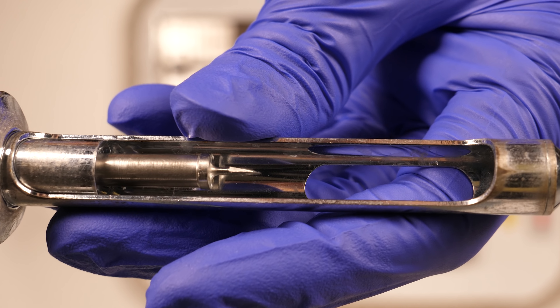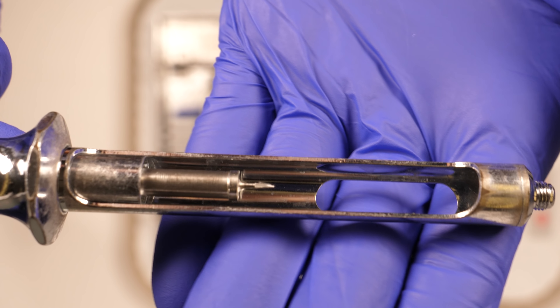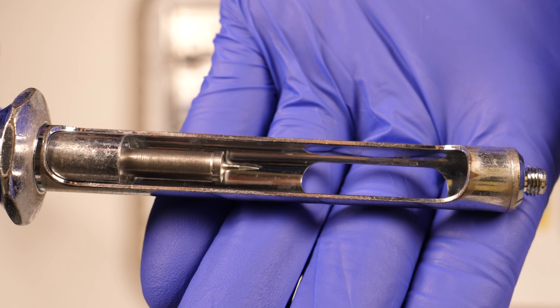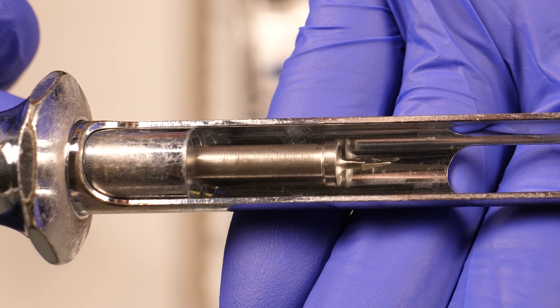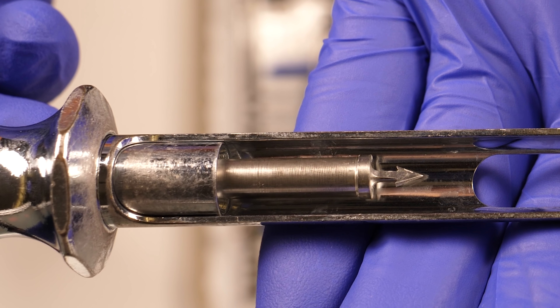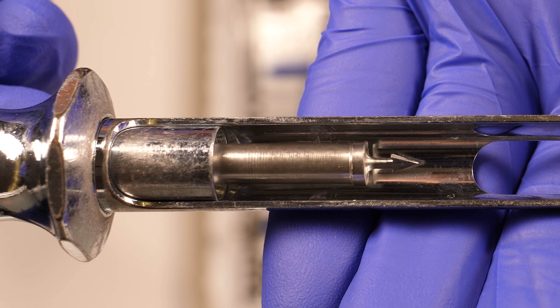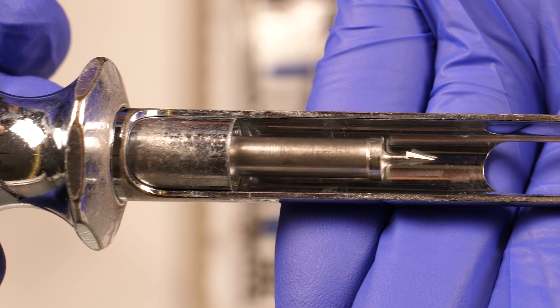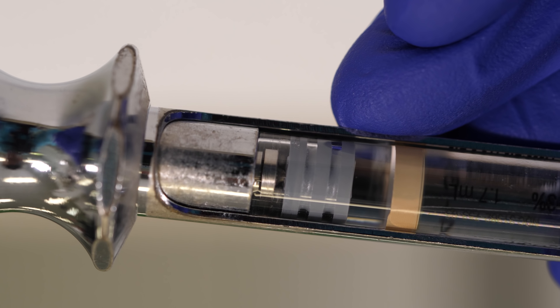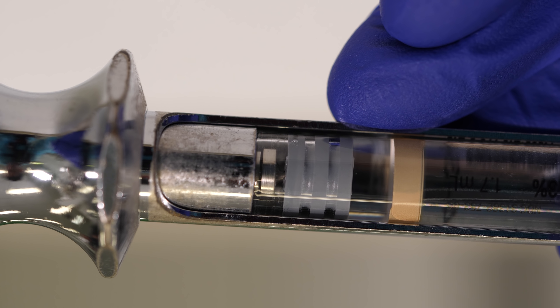The barrel of the syringe will hold the anesthetic cartridge. Inside, you will see a piston and harpoon. The harpoon, which looks like an arrow or a hook, engages into the rubber stopper of the anesthetic cartridge.